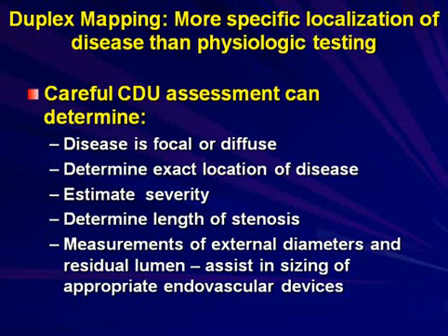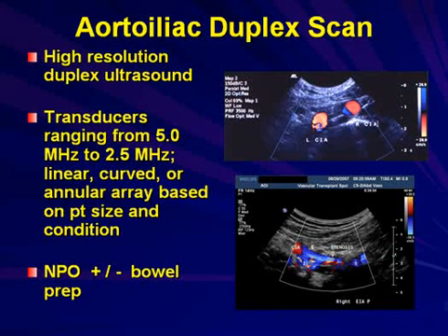And if there's adequate visualization, you can measure the external diameter and residual lumen, and that may assist in determining what appropriate endovascular device to be used to address this problem.